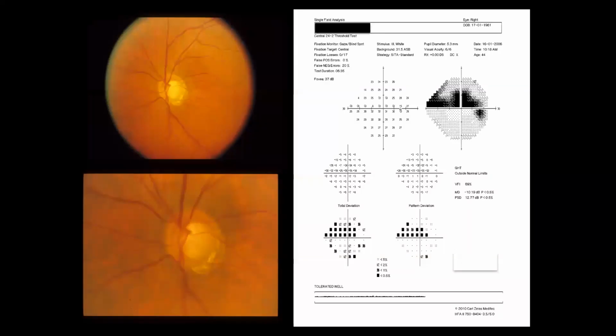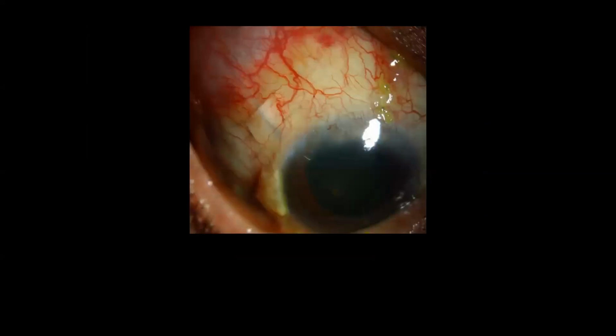Okay, so now, again, Dr. Zubair, that patient underwent a glaucoma surgery. And what kind of surgery? If you can focus here, what do you think is the type of surgery? This looks like a tube surgery. What kind of patch graft was used for this patient? Scleral graft. So here it's actually a scleral flap.